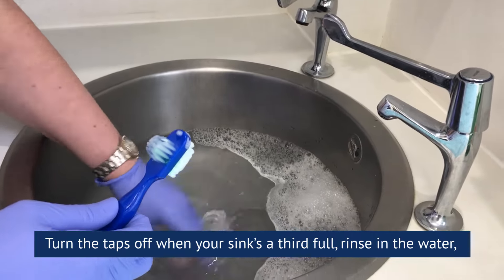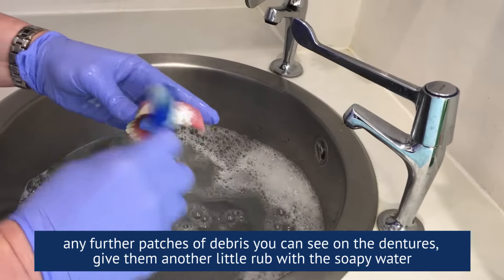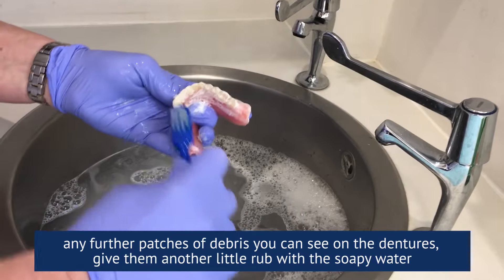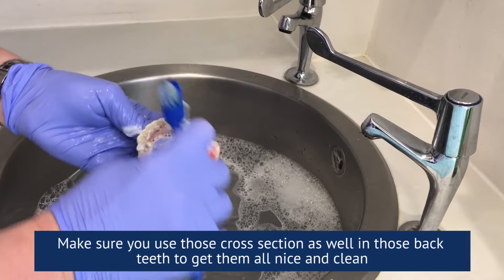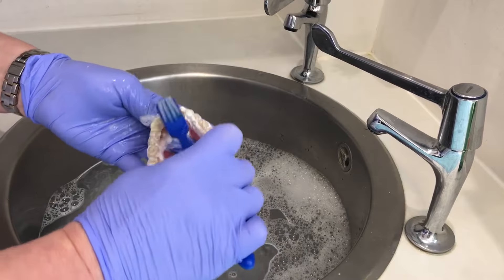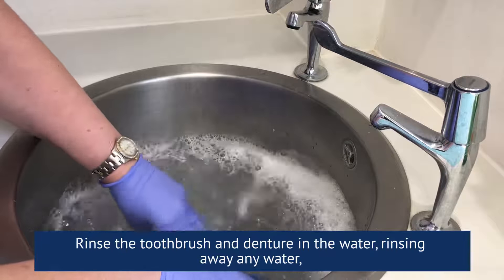Turn the taps off when your sink is a third full. Rinse in the water — any further little patches of debris you can see on the dentures, give them another little rub with soap and water. Make sure you use a cross-section as well on those back teeth to get them all nice and clean.